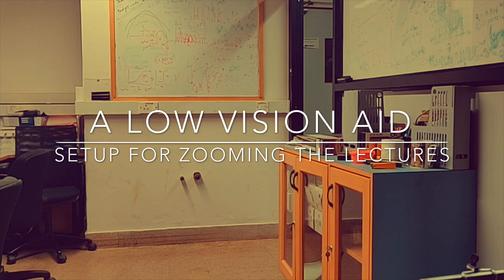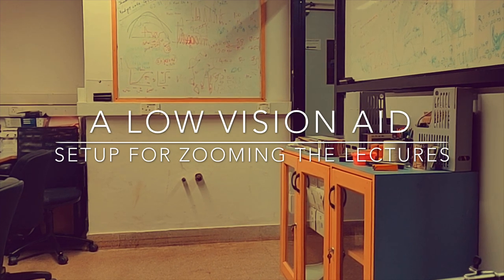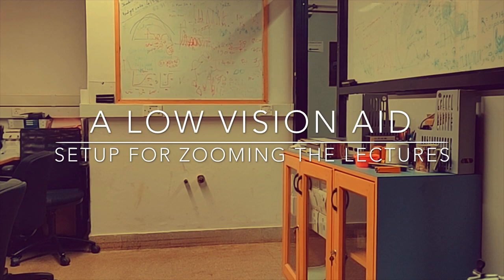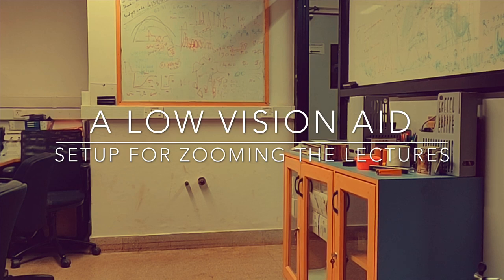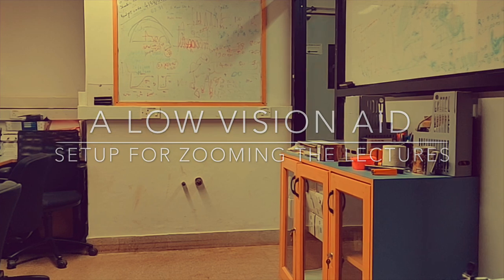I had realized this earlier that many students like me who are suffering from low vision disorders had this issue where we are not able to see what exactly is going on the board or on the projector screens during the lecture, and we completely relied on our listening. So what we have done here is we have designed a basic setup which basically zooms onto the content of the board or the screen during the lectures. So stay tuned to see how exactly to build the setup.